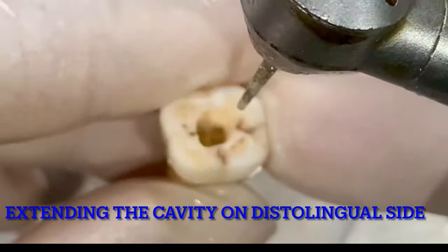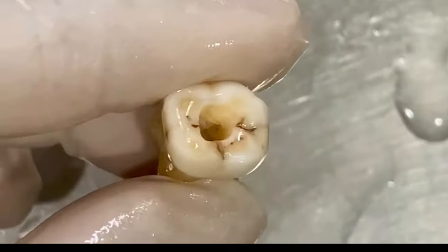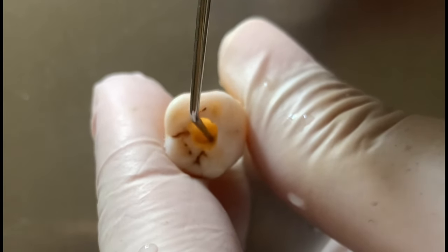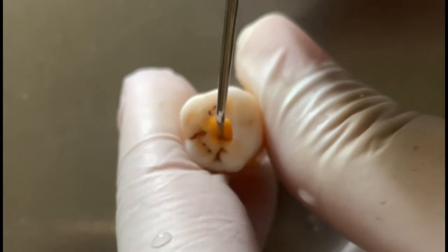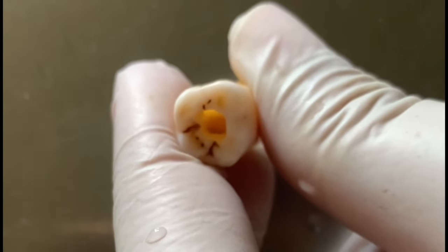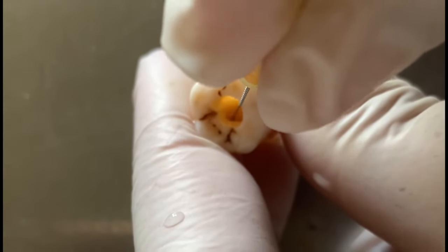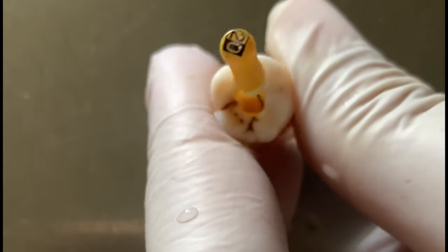Now I will try and locate an additional distal canal if it is present. For this I have to cut more on the distolingual side. I used an Endo-Z bur — it can be done with a straight bur as well. With the help of the probe I move on the distolingual side and try to feel for some catch, but I can't feel anything. With a file I also try to feel if there is any dip or orifice, but there is none — so we have only one distal canal, and that is on the buccal side.